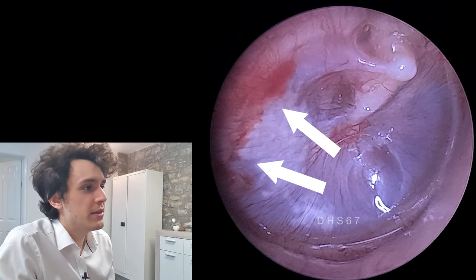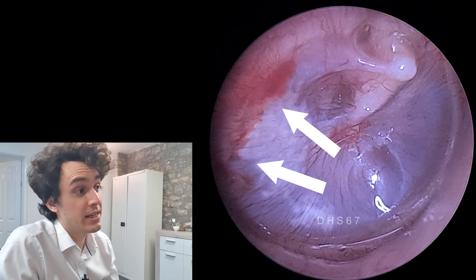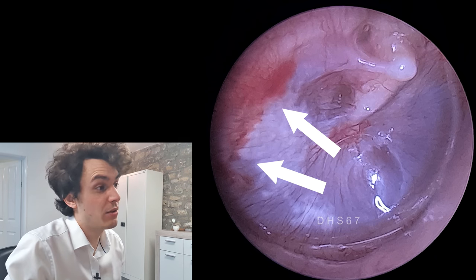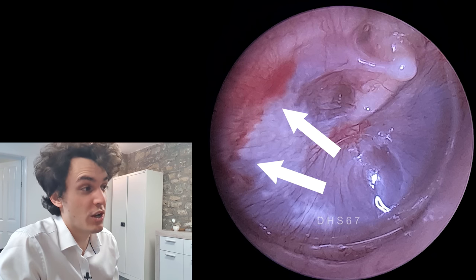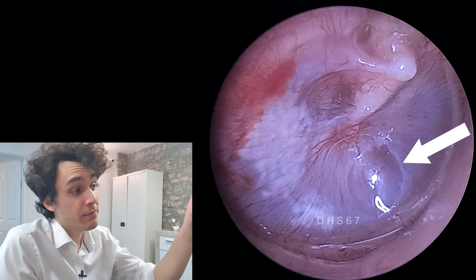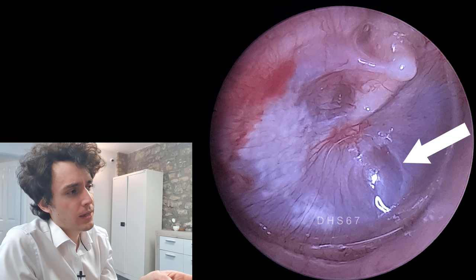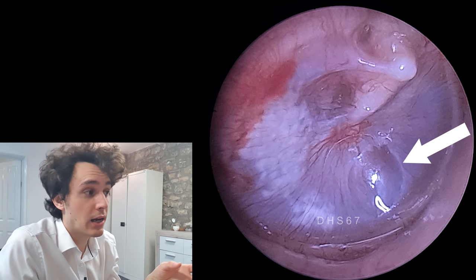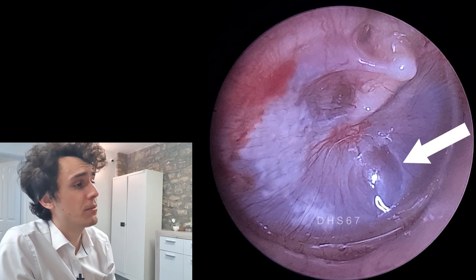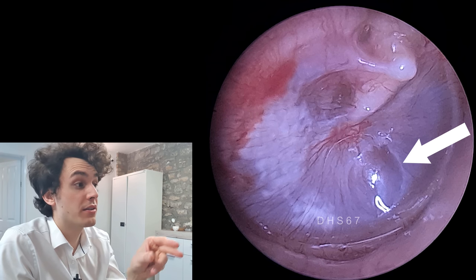There's the eardrum — you can see a little bit of bleeding on the left-hand side. It's not pouring out, but it is bleeding underneath the skin — you could call that hemorrhaging, ecchymosis, or hematoma. And that circular section there is where the grommet would have been inserted. Obviously it's healed back up, possibly slightly thinner than the rest of the eardrum. That patchy white cloudy debris on the left-hand side is scar tissue.